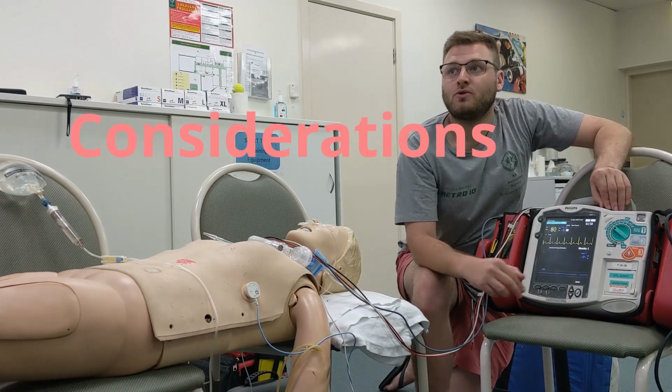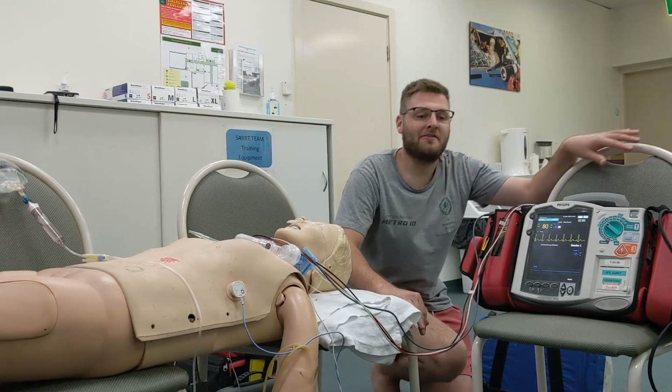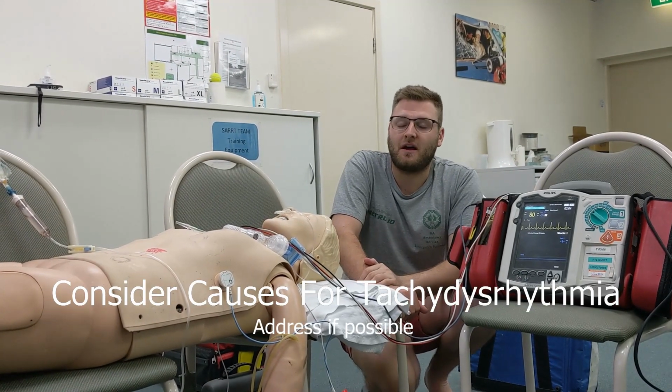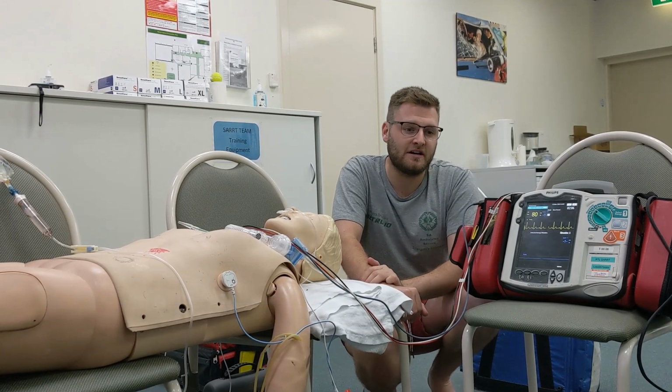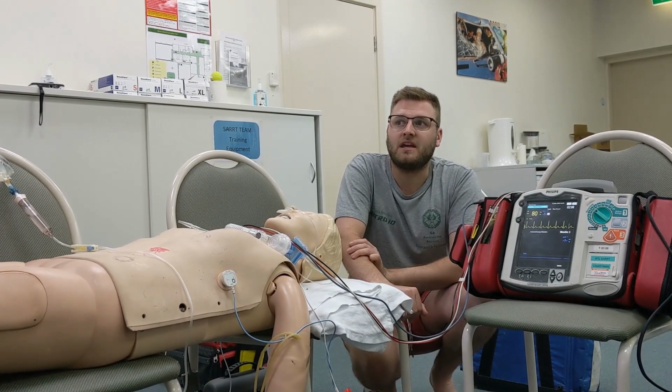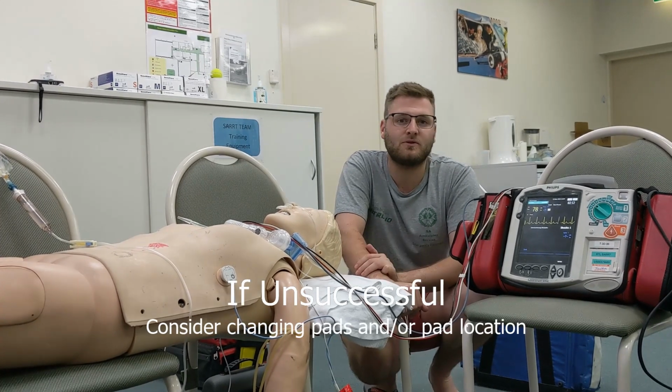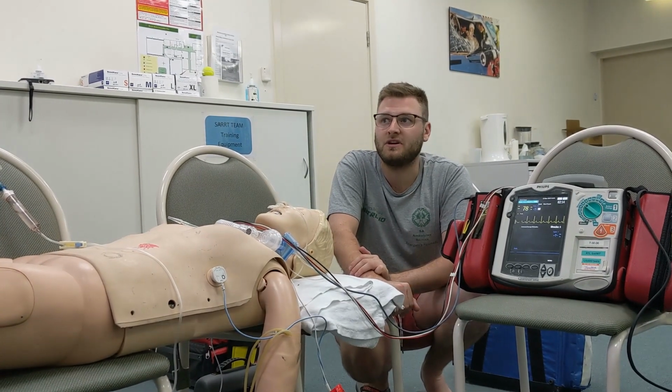So for considerations, you always need to consider any other potential cause for the tachydysrhythmia and address that if you can before commencing this procedure. If the cardioversion is unsuccessful, perhaps consider changing your pads or confirm that your pad placement is good.